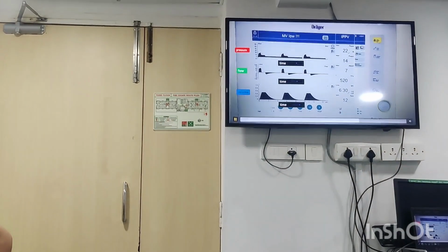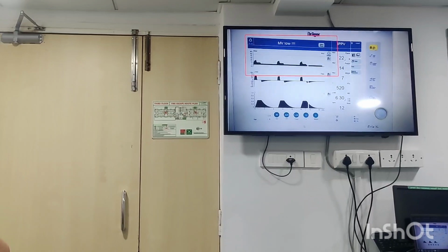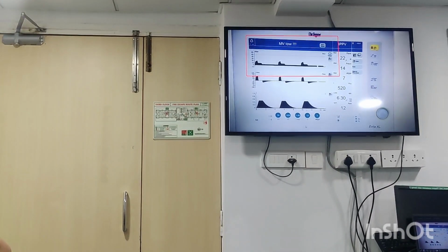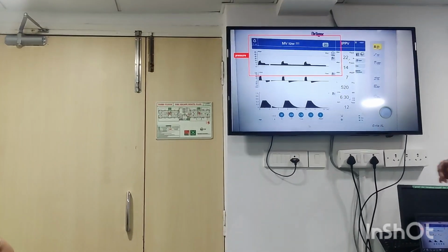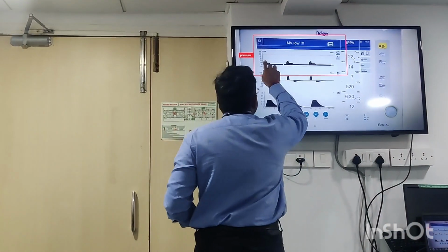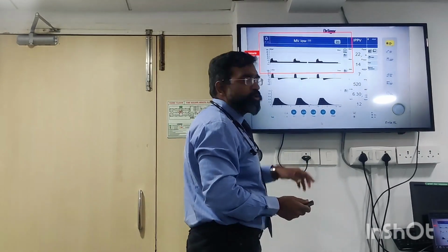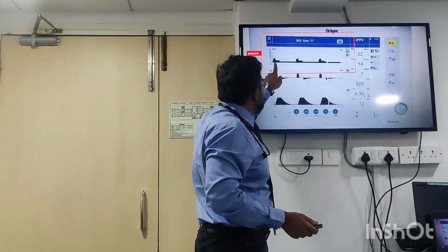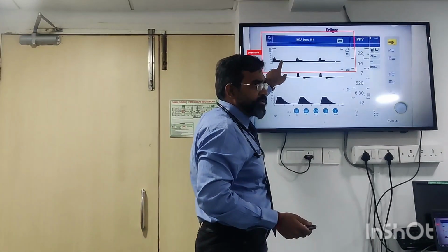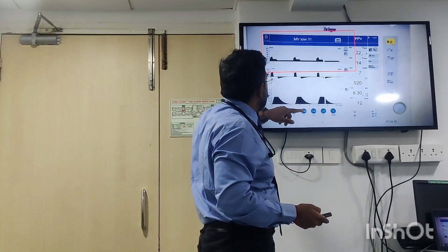Now we'll come to all of those breath types. Now look at this. Now you have this pressure type. Let's go to the pressure type and see what this looks like. All right, this is the pressure, right? What I'm seeing over here, the topmost part is my peak pressure, 22. I have a pause in the middle, that is my plateau pressure. Clear on this till now? What I'm seeing is my peak pressure. Right? Clear?